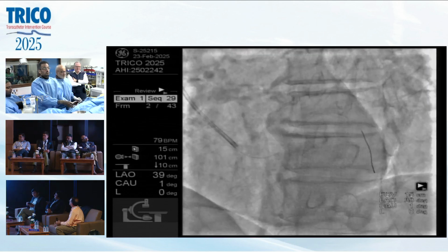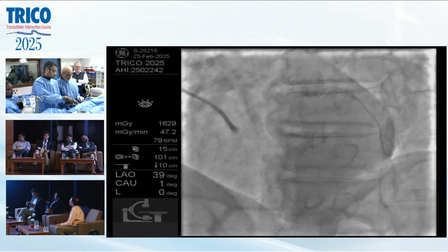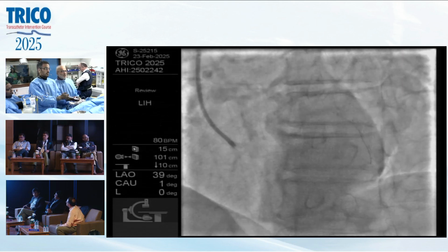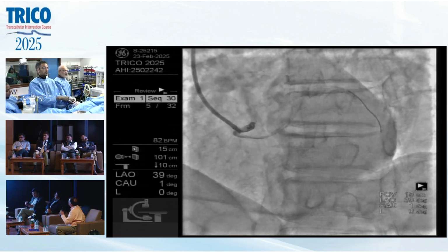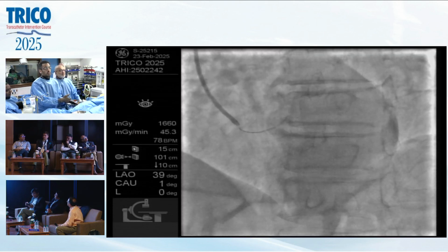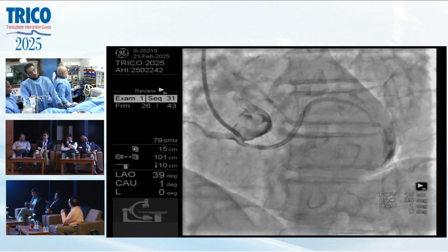It looks better now. It looks better expanded, for sure. Scout. Inject a little bit. Yes. Inject. Yeah, better. Okay. I think it looks very good. Wire, and see some concertina. Wire, we are pulling it back. You want to see now, just check it. Yes, now it looks good. Perfect. I think it looks good.